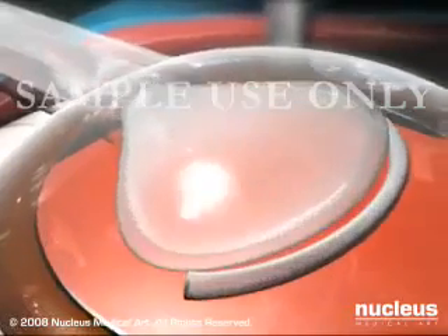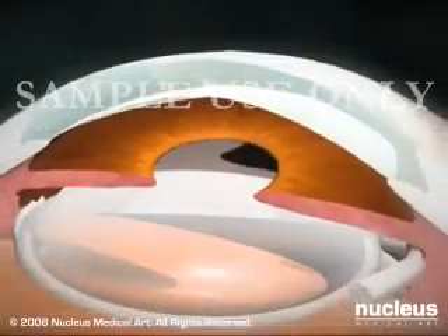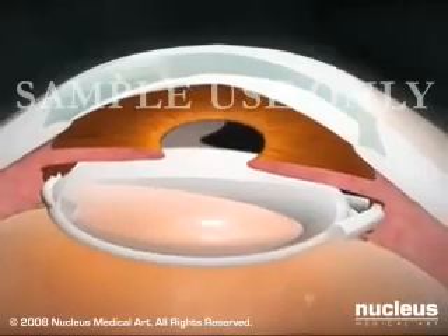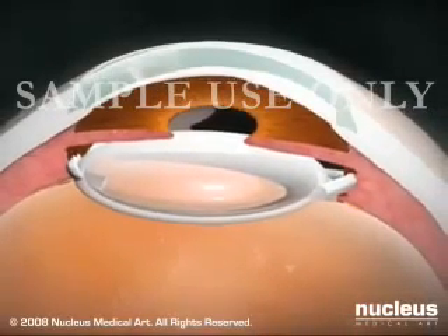Then, an artificial intraocular lens is inserted. Intraocular lenses, made of plastic, silicone, or acrylic compounds, have no moving parts and last for the remainder of a person's life.